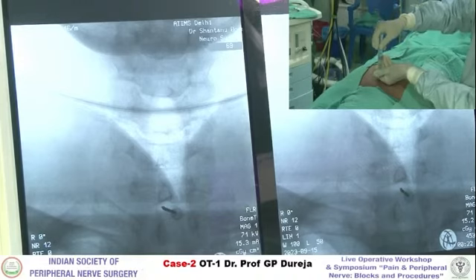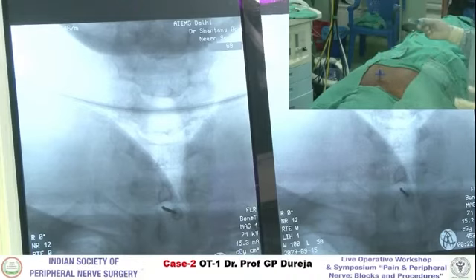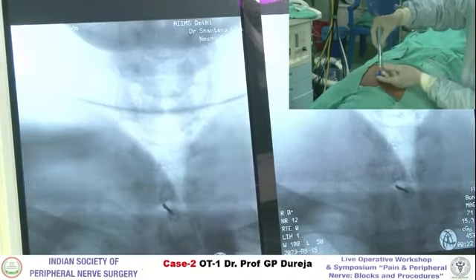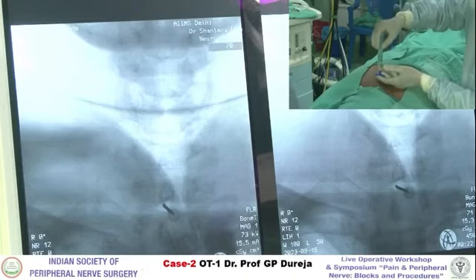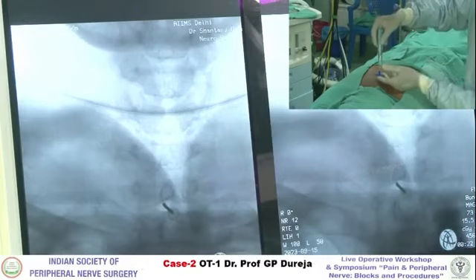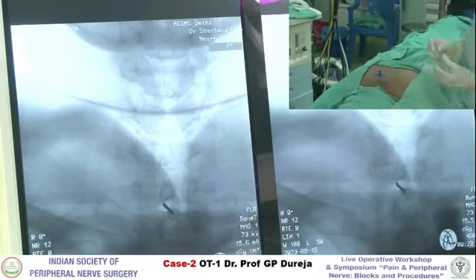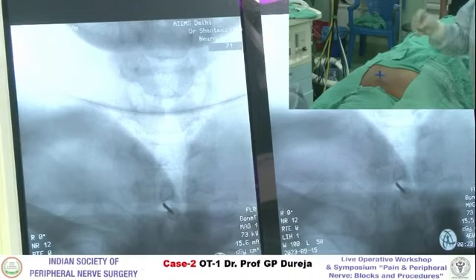So you are not going to check with the lateral X-ray, sir? We will, but the only thing is that big breasts and shoulders. So I have already reached there. You can see the loss of resistance. I have reached there. Okay. So from the sudden things which I was showing now, I can push my air easily. Okay. Yes, sir. So final position, please. Final position. Yeah, this is the final position.